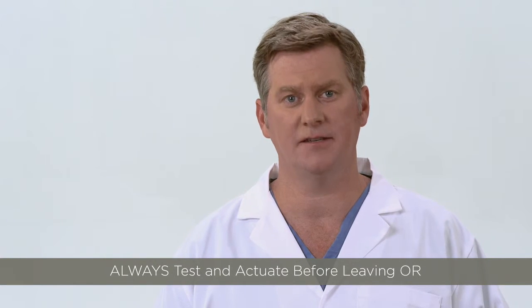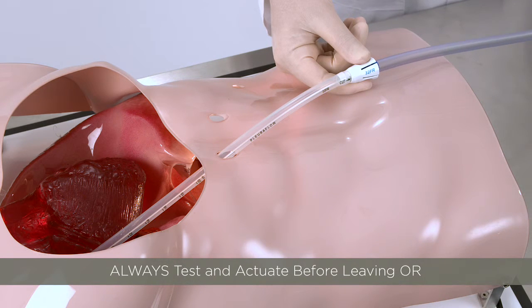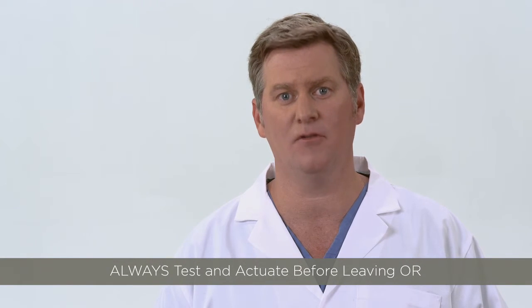As a final test, before the patient leaves the operating room, simply actuate the clearance wire and loop to make sure it can travel smoothly through the chest tube. This will ensure that the PleuraFlow System is functioning as intended before the patient is transferred to the ICU. If any obstruction is noted, it can quickly be addressed before the patient leaves the operating room.